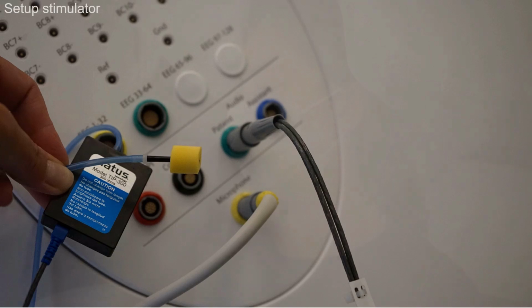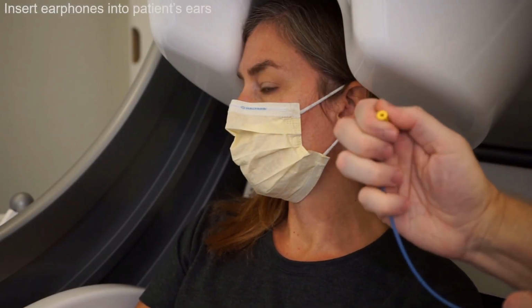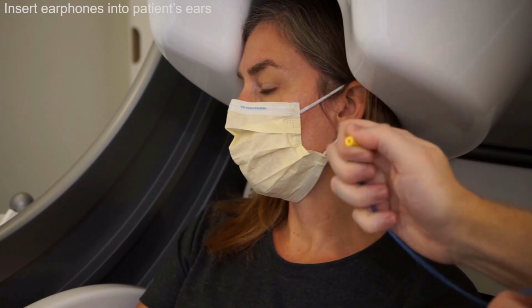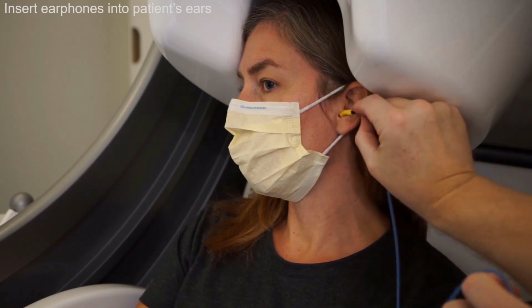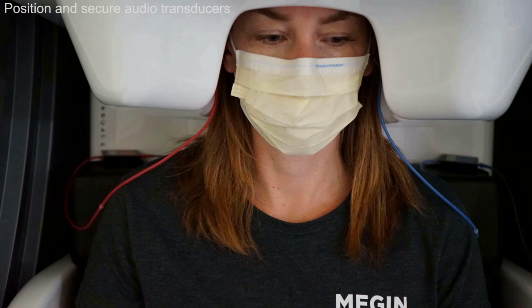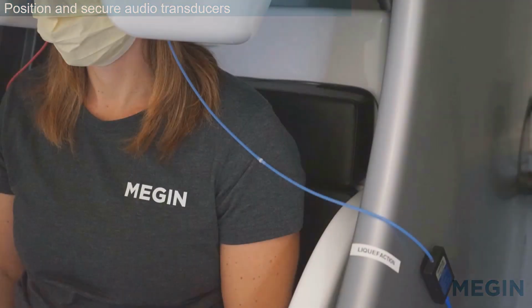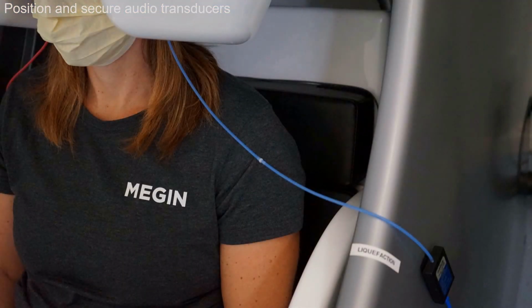Prepare the subject with the earphones, being sure to select the correct size, small, medium or large, to fit comfortably. Squeeze the disposable foam plugs and insert into the ear. By convention, blue in the left ear and red in the right ear. Wait a few seconds for the plug to expand. Place the transducers on the back of the chair or side of the bed to reduce the risk of movement. They will cause artifacts otherwise. Alternatively, the transducers can be fixed to the gantry to keep them from moving.